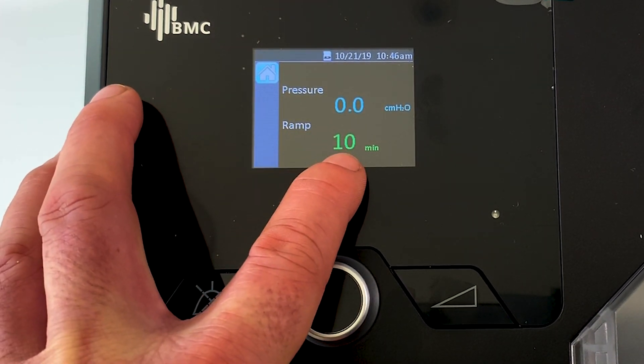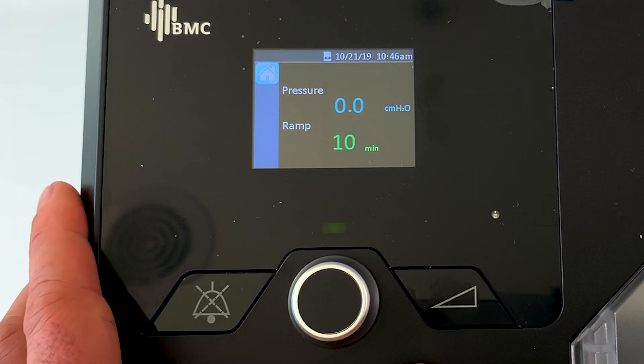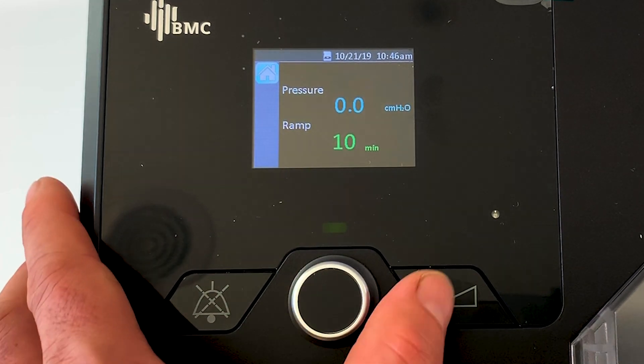We're going to go back to home - that's the clinical settings, pretty straightforward. At the moment the ramp time is 10 minutes, so that means it's going to go from four to five over 10 minutes, and then it's going to go between five and 20 depending on what's required.